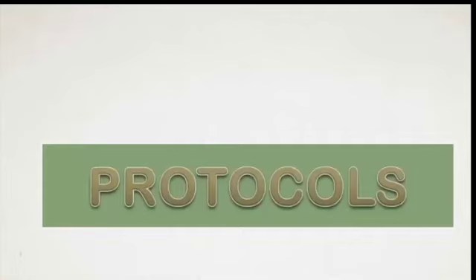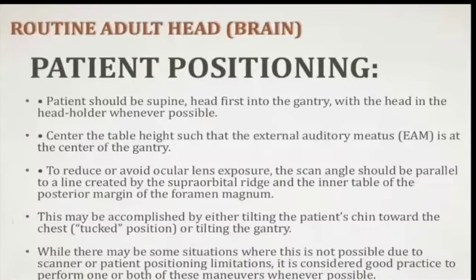So before we get into imaging, let's take a rapid look at the common protocols for a head CT. Concerning the patient's position, a patient should be supine with the head in a head holder. Now the head should be in a tucked position for the patient's safety. By the tucked position, we mean that the patient should tilt their chin towards the chest. And we scan from the cervical spine C1 to the top of the calvarium. And by the word calvarium, we mean the skull cap.